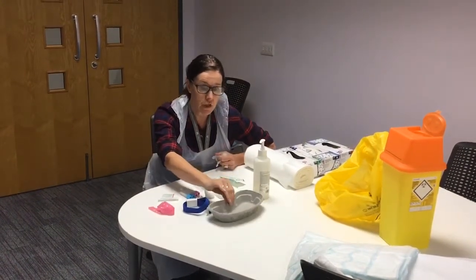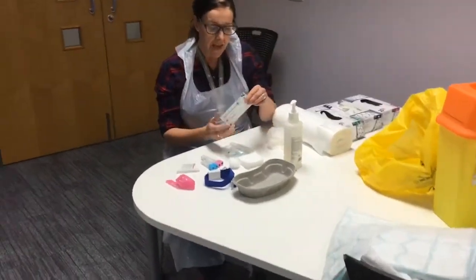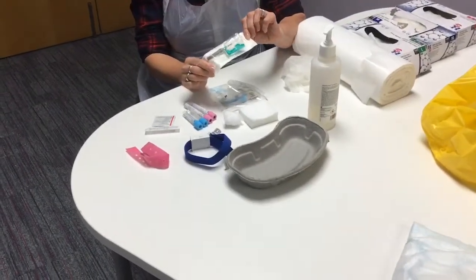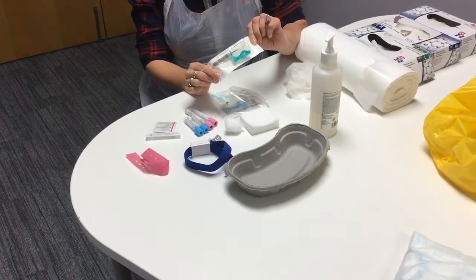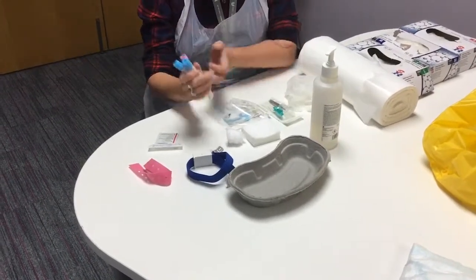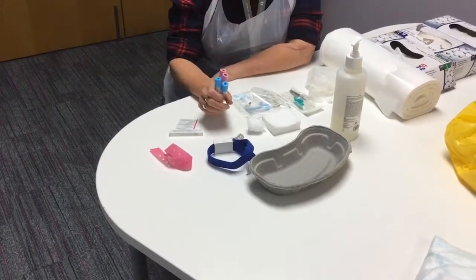You'll need a kidney dish to put all your bits and pieces in. You'll obviously need a vacutainer, or whatever is used in practice — it might vary in your clinical area, but this is what we normally use when we're taking blood. And you need your blood bottles, so make sure before you're going to see your patient that you have got all the blood bottles that you need.